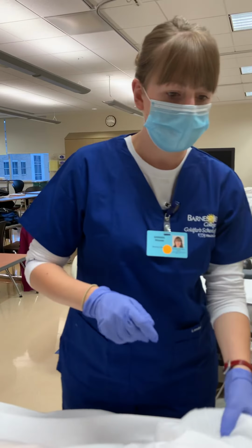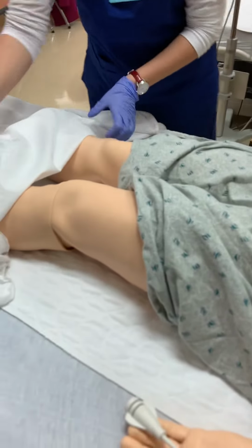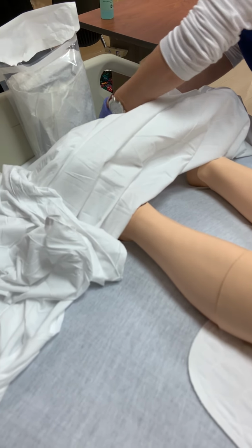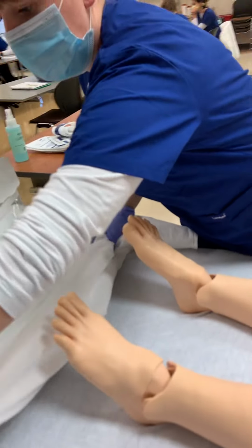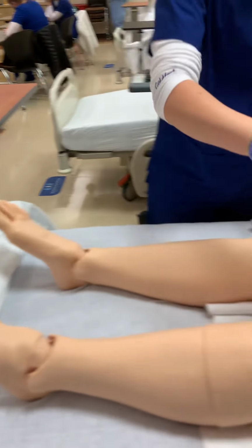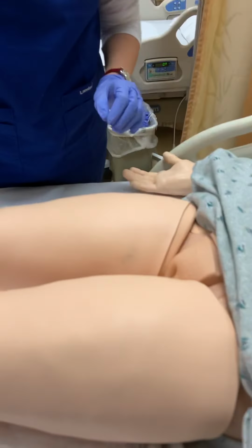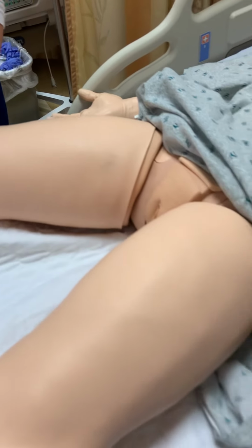If you don't mind, I'm just going to take this sheet down a little bit just to check things out really quick. Okay. And I'm going to need your legs. You said you've had this procedure before, right? Yes, I have. Okay, so you know I'm going to have to have your legs moved outward just a little bit, if you can kind of help me with that. Okay. Perfect. Okay, and if you can just do your best to stay there.